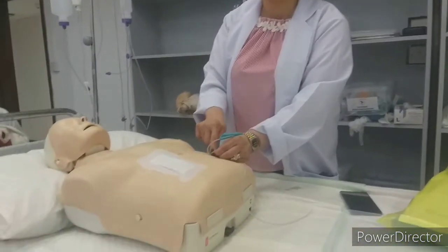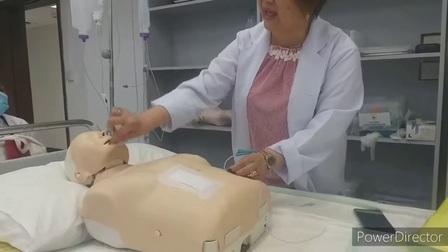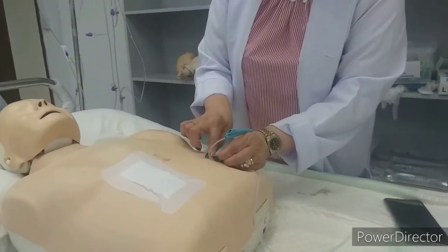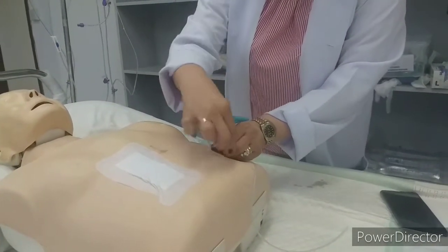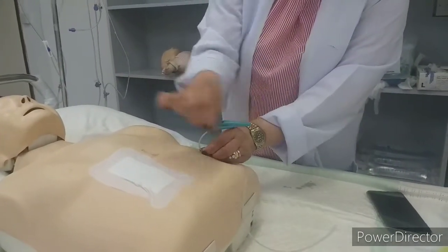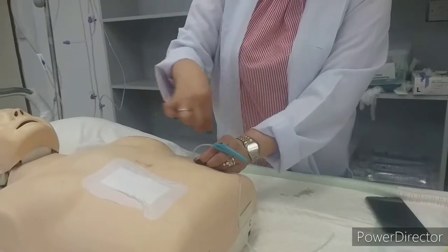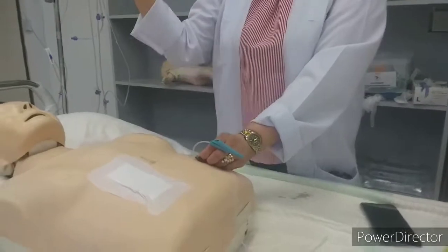In dressing, it will be circular. Tracheostomy is circular, right? So surrounding the tube, on the skin. Okay? You have to be on the skin, surrounding circular, and out. Same. Second, betadine. Surrounding circular, out. Then saline. Saline, in, out. Dry, in, out. That's all.